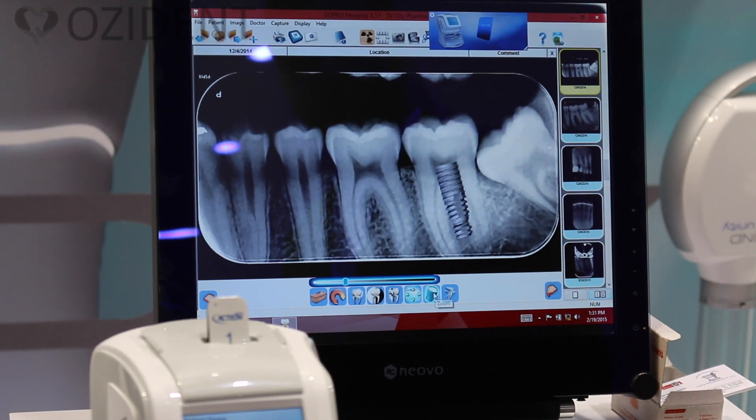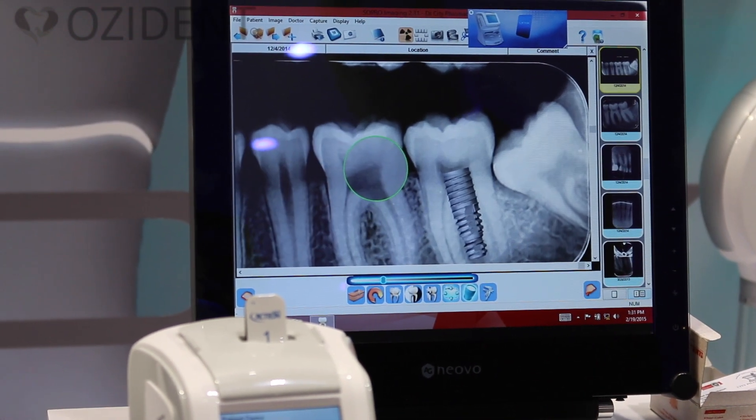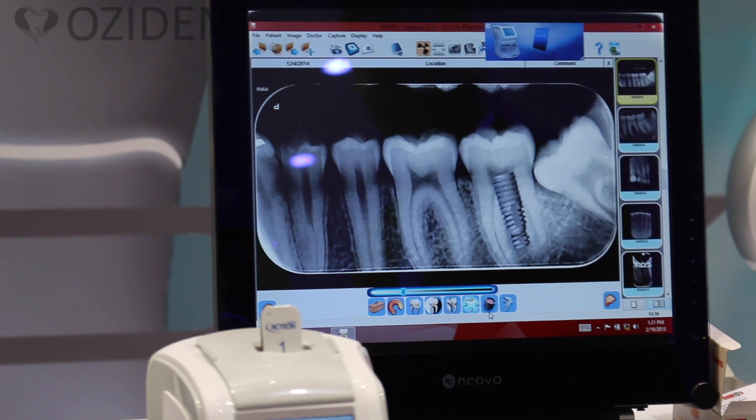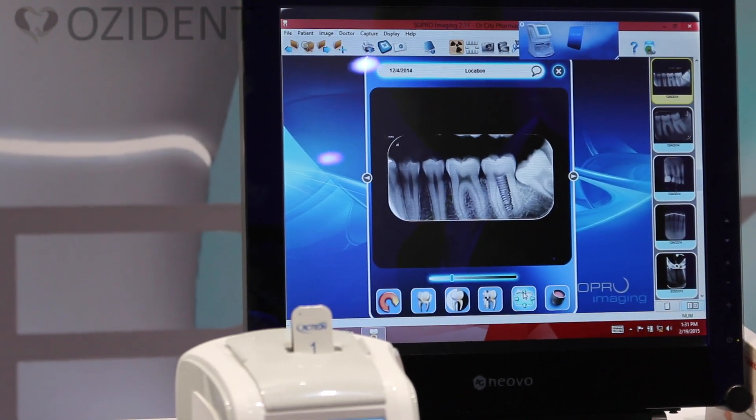Here you have a zoom option. With the left click you can zoom in, with the right click you can zoom out. Then this is for full screen mode — if you want to put the image in full screen rather than the normal window.